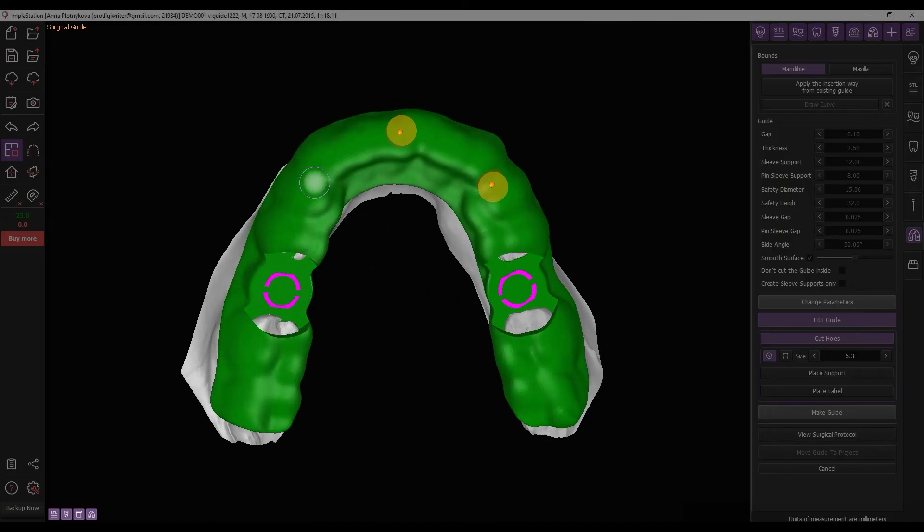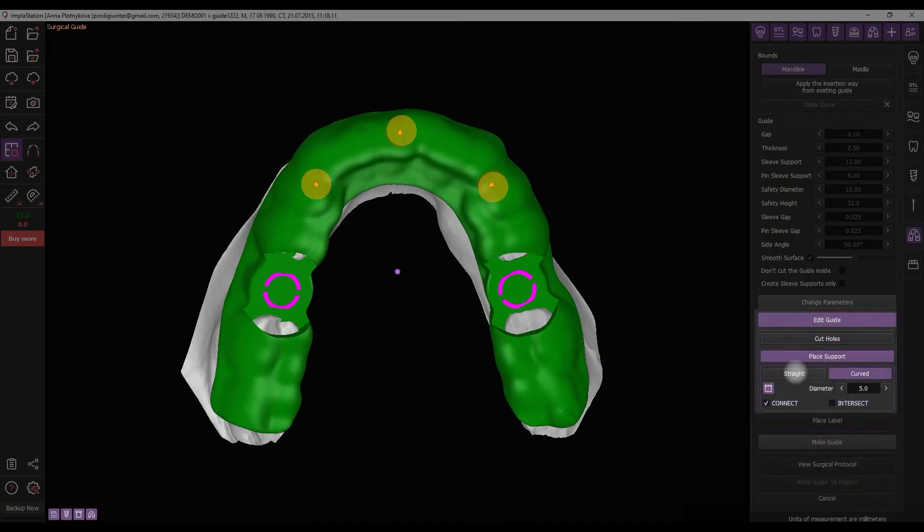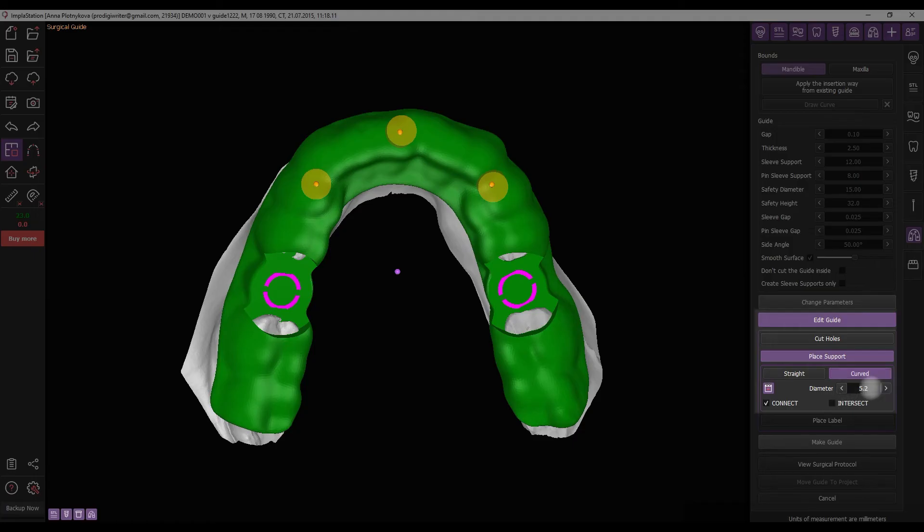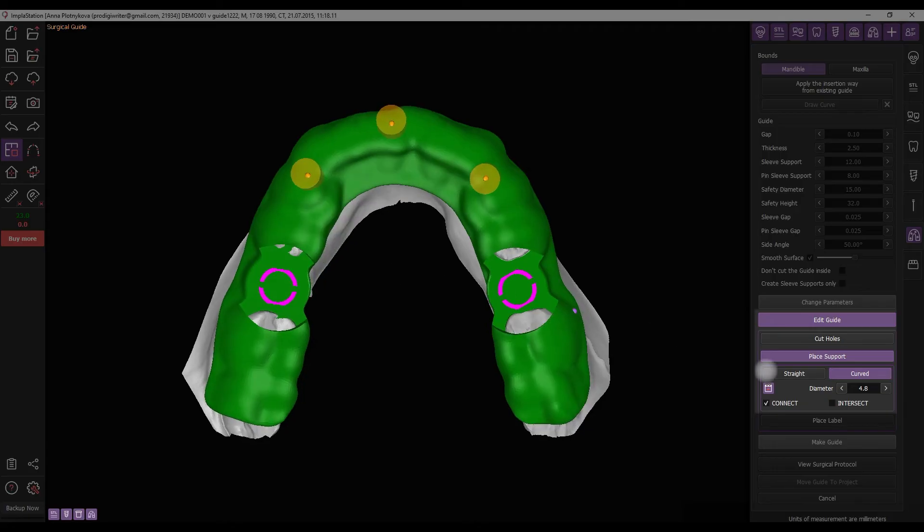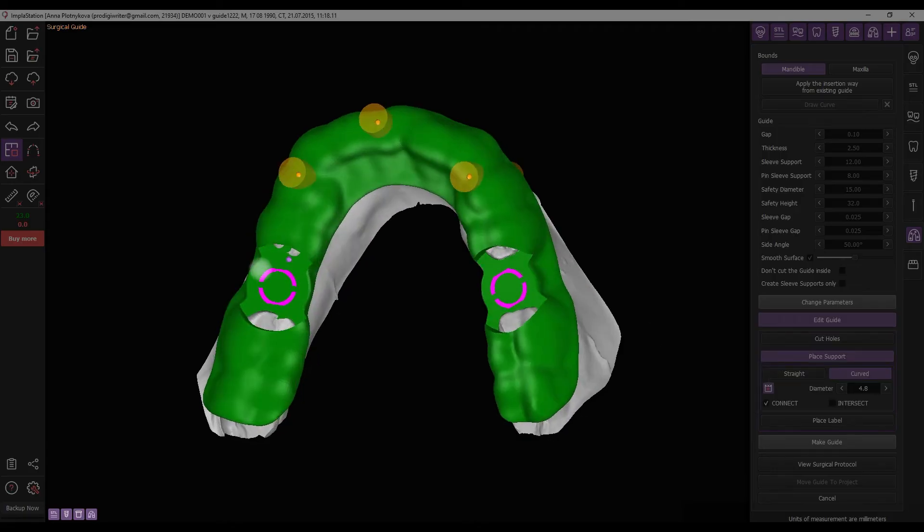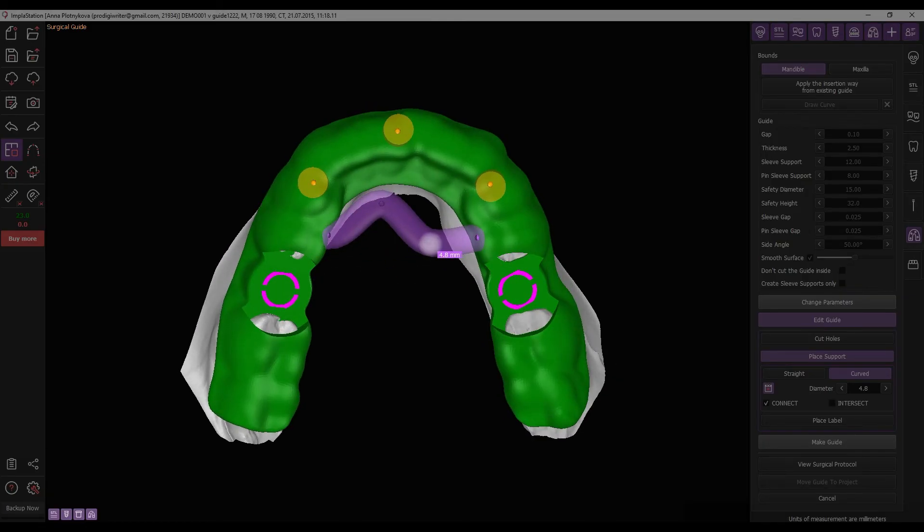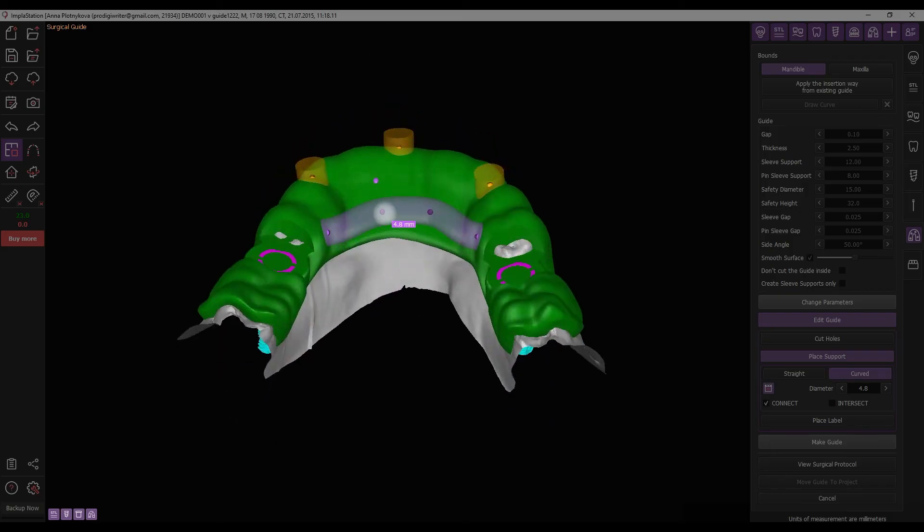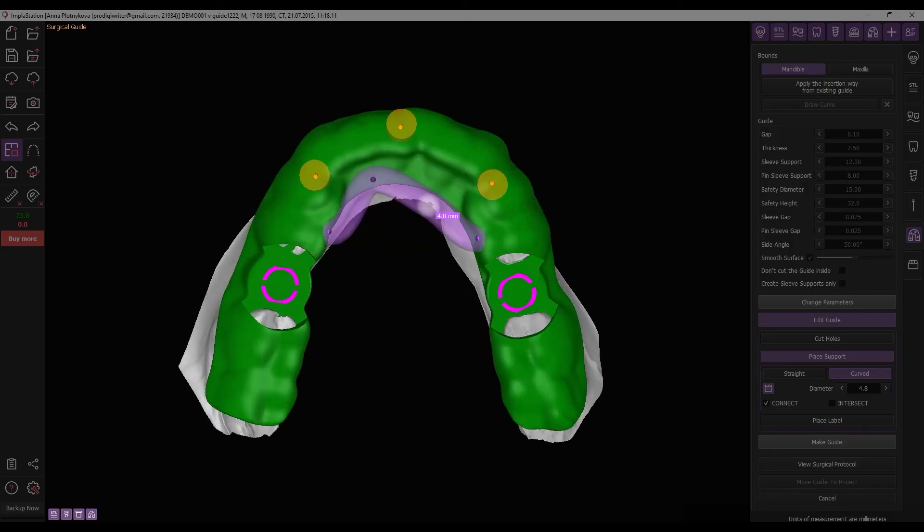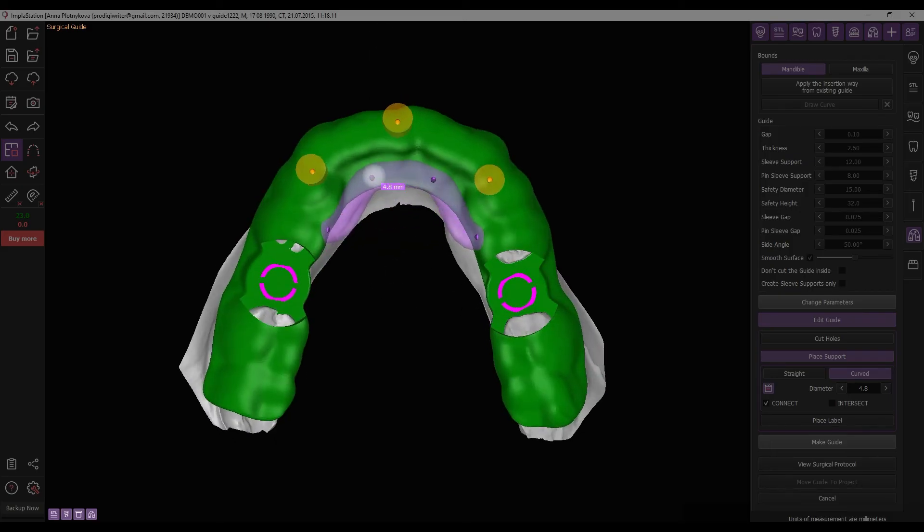For adding support bars, click the Place Support button. Choose the type, straight or curved, and set its diameter. Select either the Connect or Intersect option for constructing the support bar. Place the support bar on the guide surface and adjust its rotation and size using the provided points. Remove the bar with right-click.